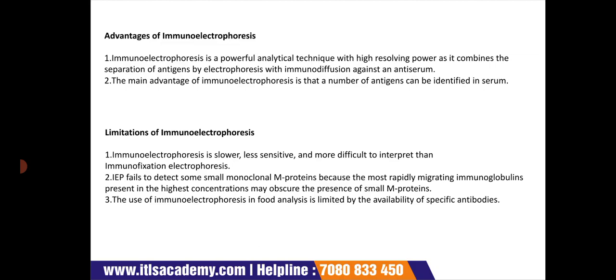Whenever you want to detect the combination of the separation of antigen by electrophoresis, this is the main technique to be used. It also has a great advantage where you want to detect the number of antigens present in a serum. So these are the advantages.